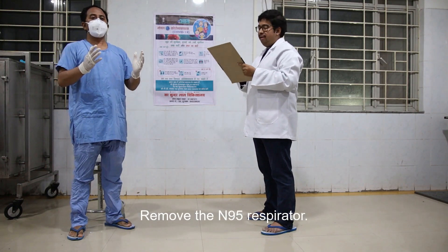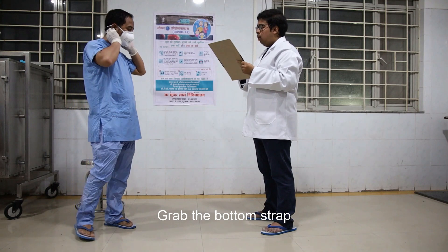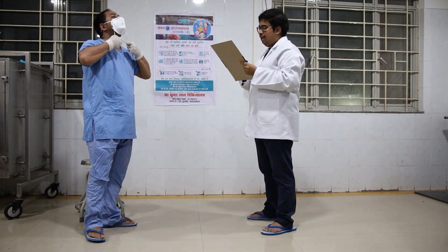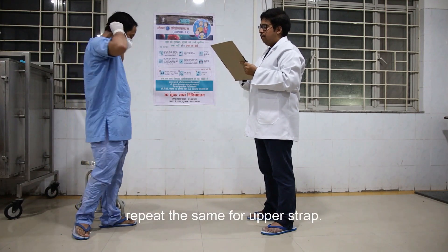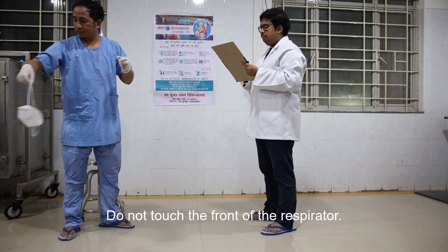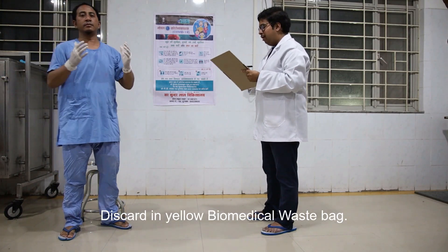Remove the N95 respirator by grabbing the bottom strap from below the ears, pulling it to the sides and over the head. Repeat the same for the upper strap. Do not touch the front of the respirator. Discard in the yellow biomedical waste bin.